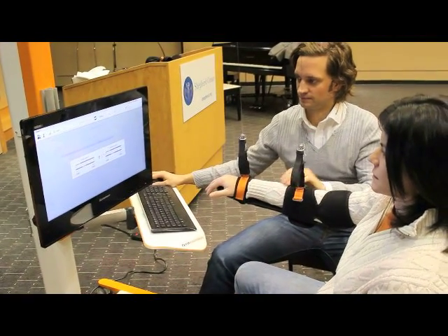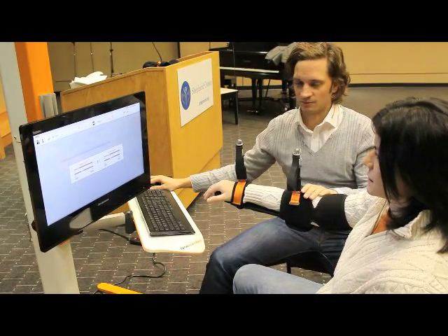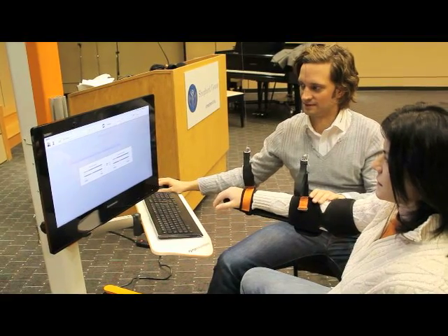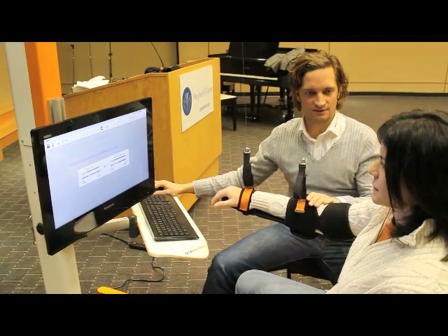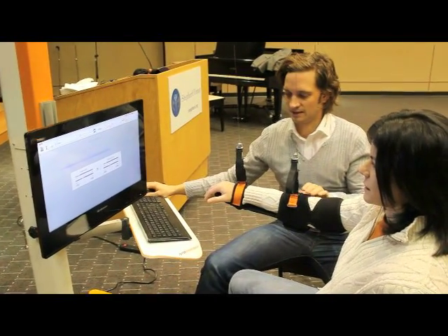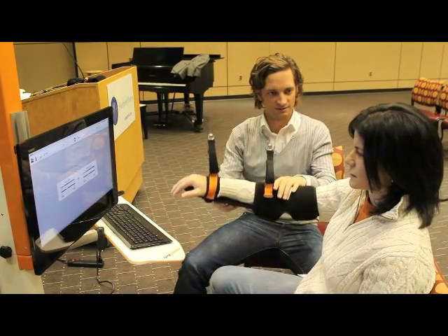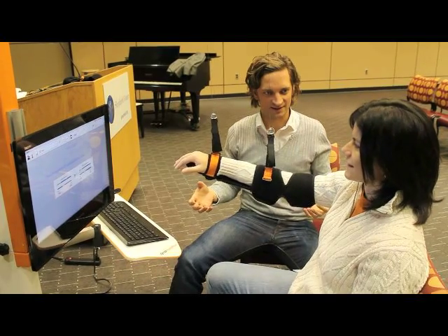Now you get weight support — you feel this? So I can give you more or less. And I can also change between elbow and wrist support. You can get it in a real nice position where the arm is completely supported.